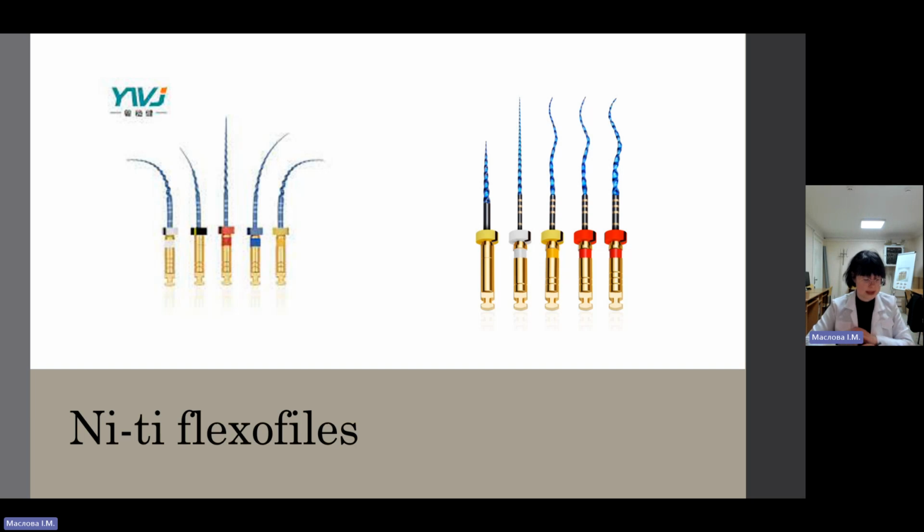Compared with stainless steel, NiTi instruments have greater flexibility in bending and better resistance to torsional fracture. NiTi instruments have a non-cutting tip, and they cannot be easily precurved. Their cutting efficiency is dependent on cross-sectional shape. They straighten curved root canals less than stainless steel instruments, producing a more centered, tapered and acceptable preparation. They also have different wear characteristics compared with stainless steel instruments, and their cutting efficiency depends on cross-sectional shape, but is less aggressive compared with stainless steel instruments.